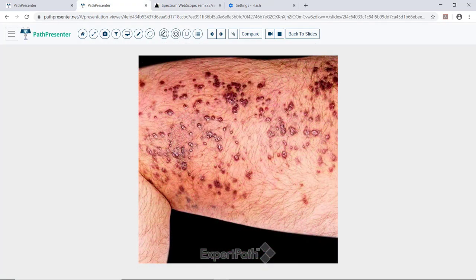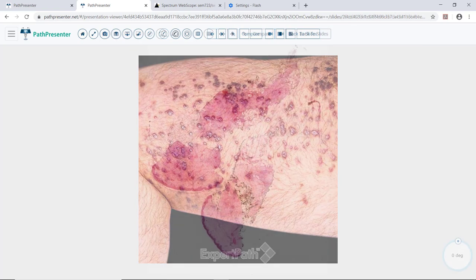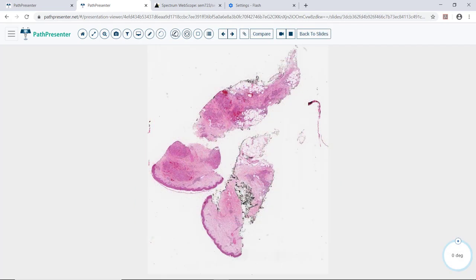Case three is Kaposi's sarcoma. You can see this is a photograph of a leg with numerous purple lesions. This is the appearance of Kaposi's sarcoma. Let's go on to the histologic section. You can see this is a skin biopsy. There is skin here and here. The Kaposi's sarcoma is here, here, and here, and there's also some down here.